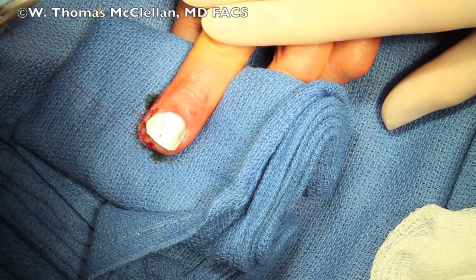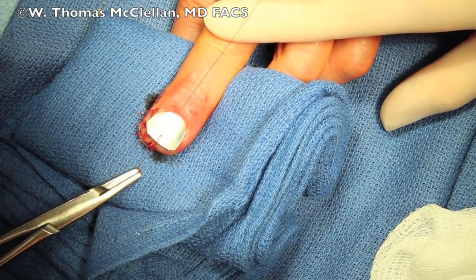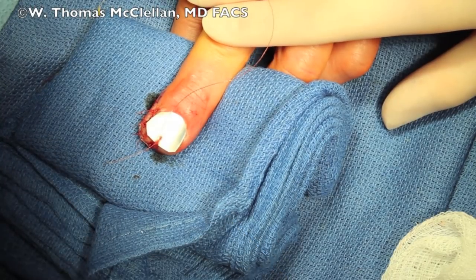The one stitch will allow bleeding or blood to escape along the sides so as not to create damage to the nail bed itself.